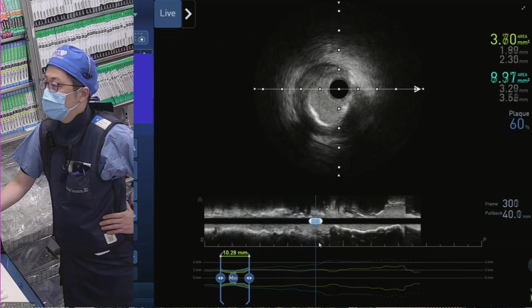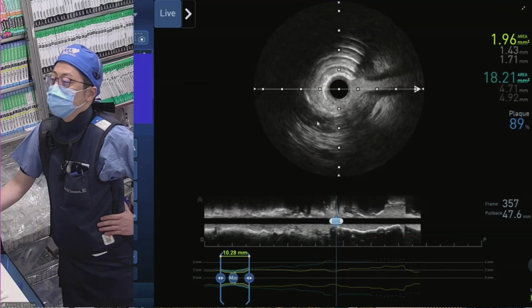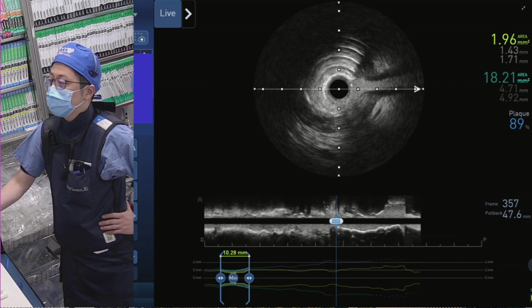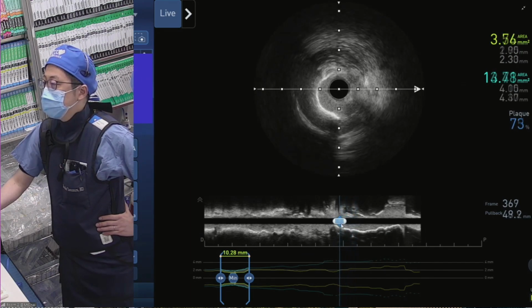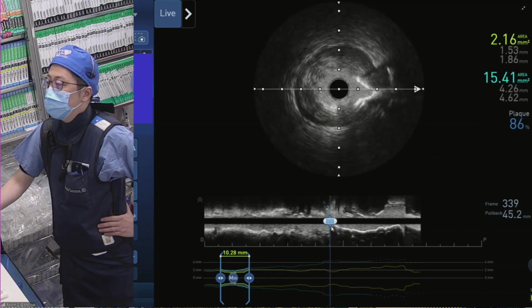But it looks like you've ablated the calcium quite nicely. Well, lots of cracks coming there. This is actually like proximal LAD, and a lot of ablation, and the surface is smooth. It's like shaped by the rotor. You saw those reverbs, those reverbs are typical rotor artifact. So pull back, come to the proximal.